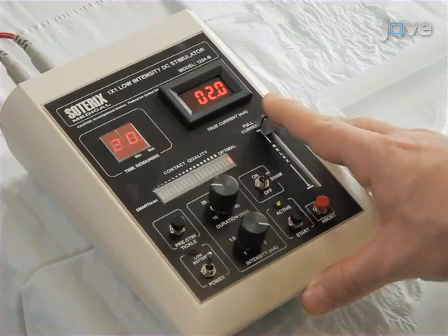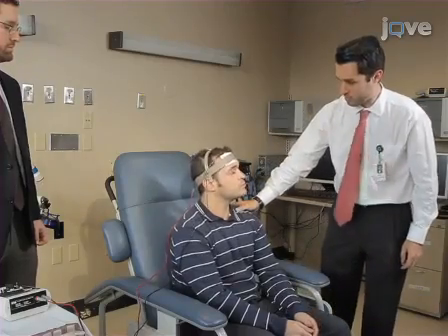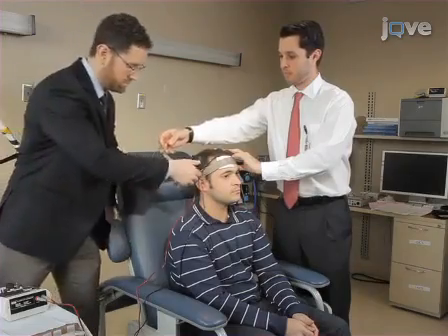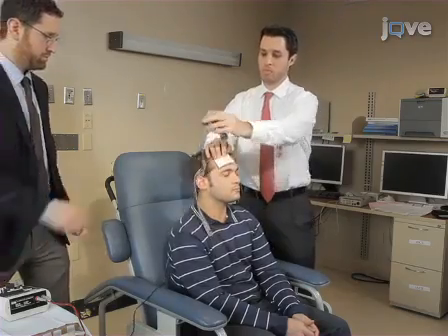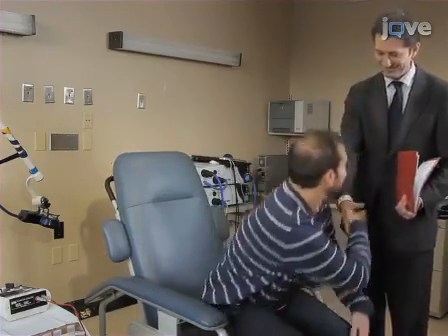When the experiment is complete, the current flow should be ramped off as well. Of note, most subjects usually continue feeling some local sensation even after current is discontinued. Inform your subject that this is not unusual. Finally, remove the electrodes and straps and answer any final questions the subject may have before leaving.